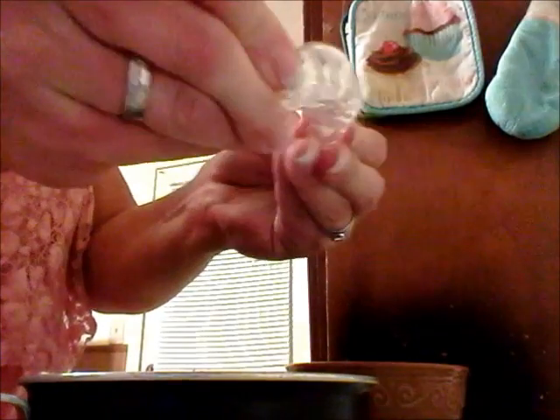It says fill a bowl with ice water. And then take your mouthpiece and submerge it in hot water for about 5 seconds. And then take it out. Your 4 fingers at the front. Now it says to quickly submerge it into the ice water and then put it into your mouth.